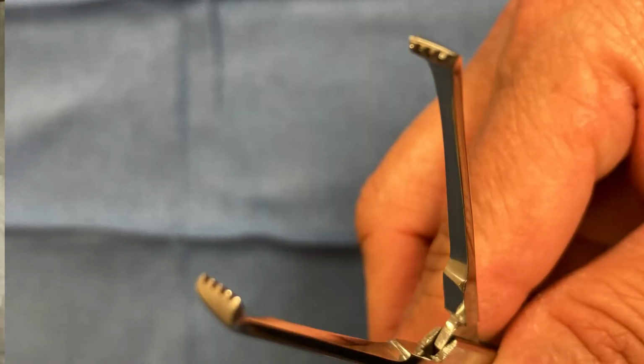The picture on screen features the jaw's tips, which have small, sharp teeth and curve toward each other on the inside of the instrument. When I look closely at the grasper teeth, I kind of see miniature fists with the teeth that are like the knuckles showing. Pow, pow! But I'm also reminded of how grateful I am for anesthesia and for modern medicine.